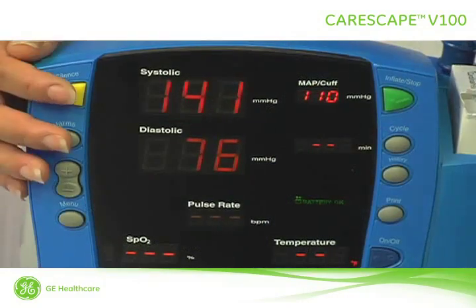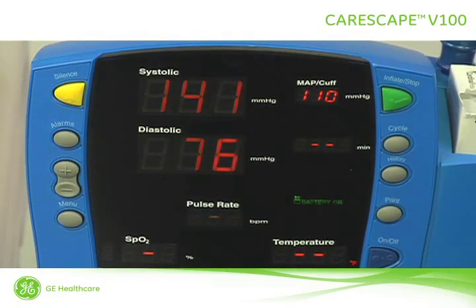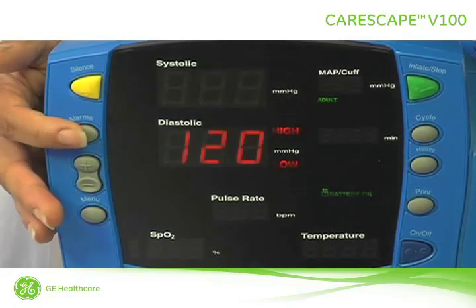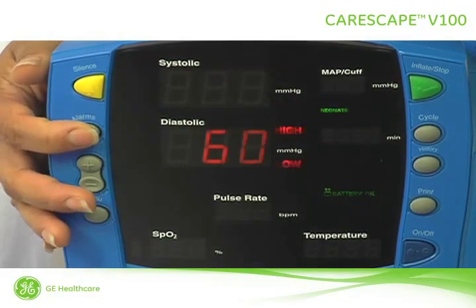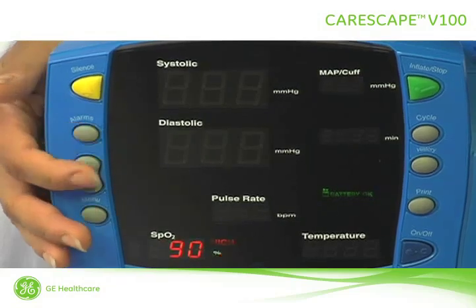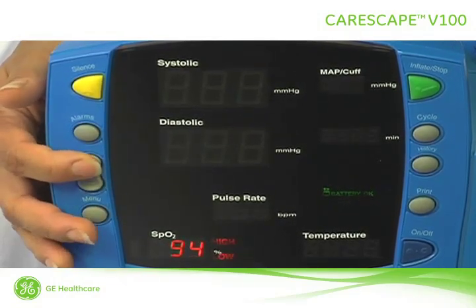The silence button disables the audible alarms for two minutes. Pressing silence also clears any active alarms that can be cleared. To view or change the alarm limits, use the alarms button. Separate systolic and diastolic limits can be set for adults, pediatric patients, and neonatal patients. Pressing the plus or minus buttons will adjust the high or low level alarm limits for systolic, diastolic, heart rate, and SpO2.